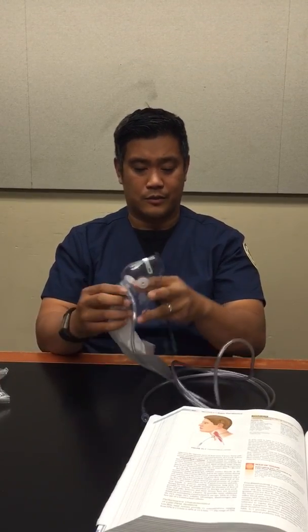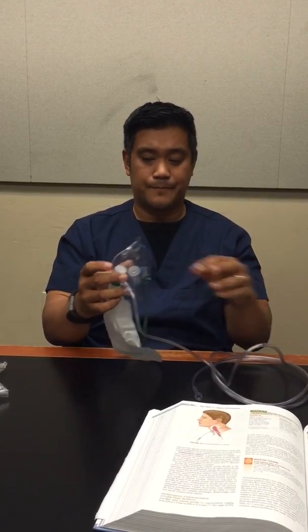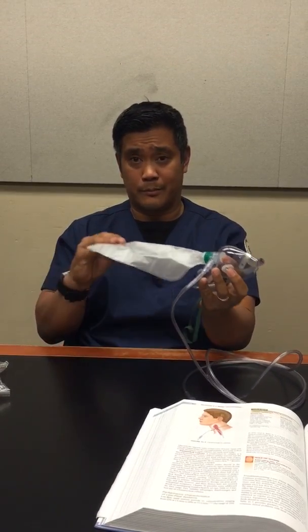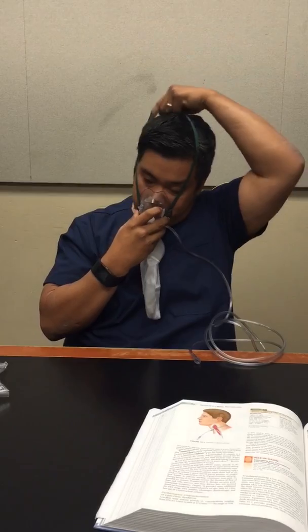To wear this device, once you attach it to your oxygen, press your finger against this port, allow the oxygen to flow in and fill the bag, and it would attach the same way as a simple mask does. Again, just put your chin over, put the strap over the head, behind the ears, adjust as needed.